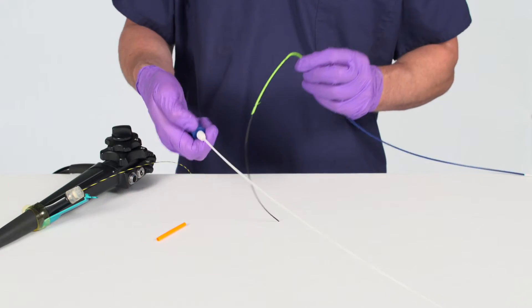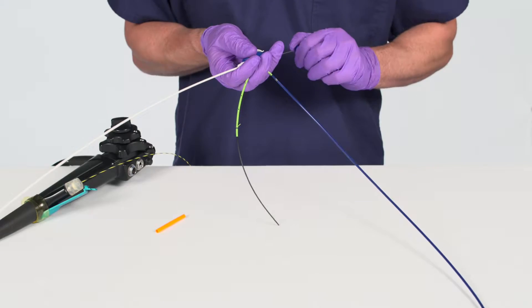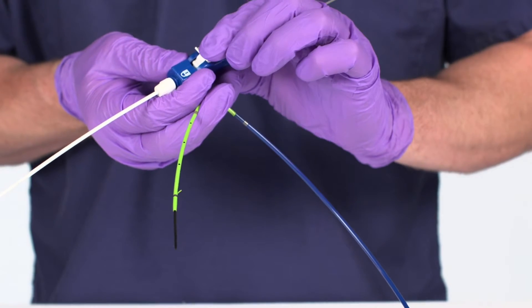Pull back on the pull wire cap to adjust the length of the guide catheter in front of the stent and engage the Naviflex RX Delivery System locking mechanism.